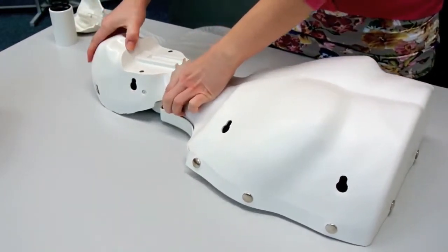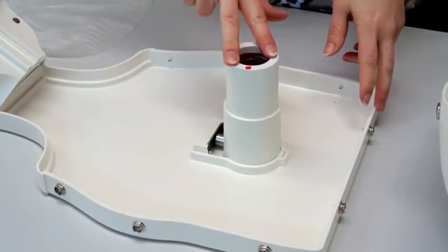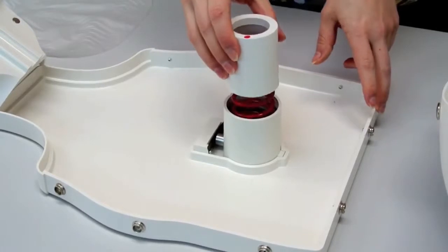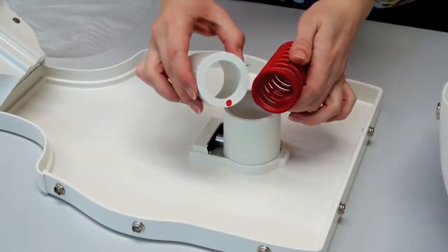Tilting the head back will make it easier to remove the thorax cover. The compression springs can easily be changed. Red for adult and green for child.